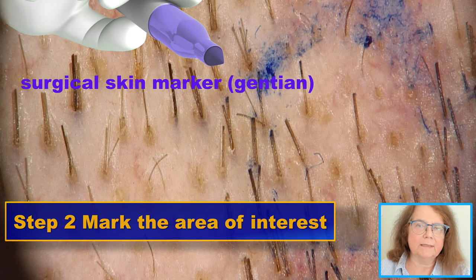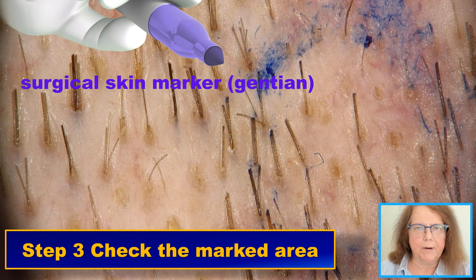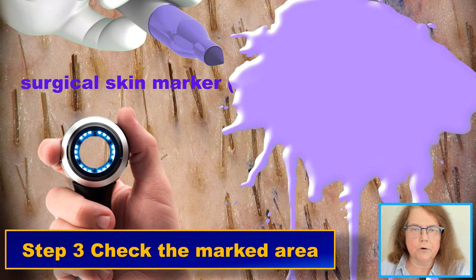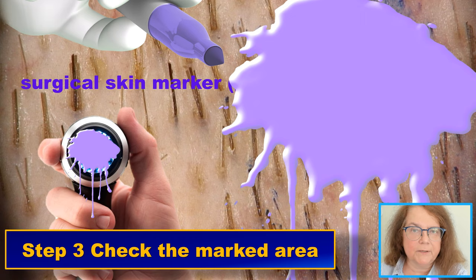Once we have the circle, we need to perform another trichoscopy to check whether the circle really includes the trichoscopy features we wanted to catch with the biopsy. This is a tricky part because when we use a marker, it leaves a wet spot, and we need to leave some time for the marker to dry — otherwise the image will become not visible, and the same may happen to our dermoscope. So we need a little time for the ink to dry, and then we redo the trichoscopy.